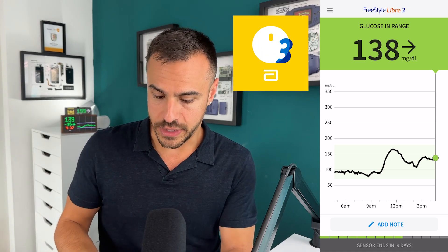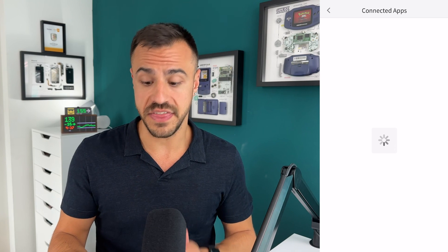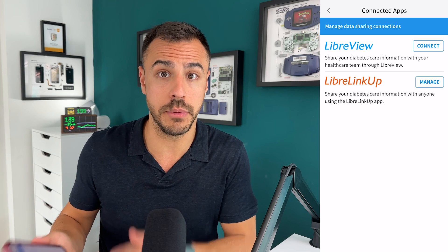Let's get into this. The first thing you're going to need is a Libre sensor, whether it's the 3 or the 2. You're going to create an account, have that app on your phone, and then you can move from there. Next, what you're going to do is go on to the Libre 3 app and go down to Connected Apps. This is where you'll find the LinkUp app, and that's where you can share your readings to other people.